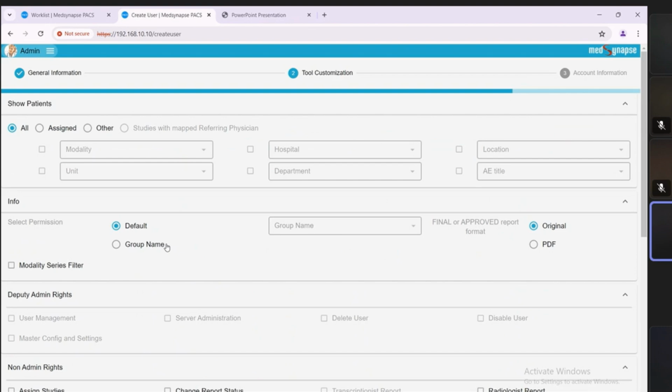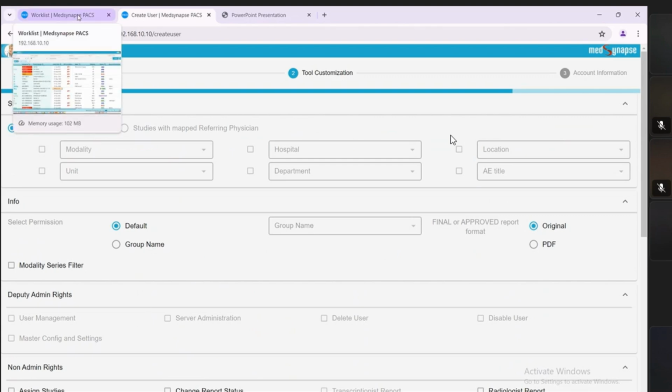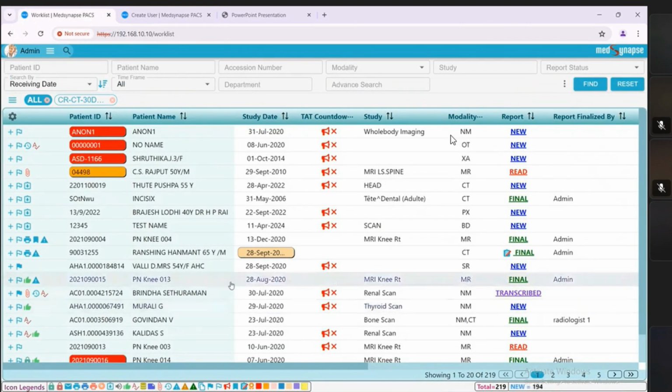But Mr. Sanjay, the radiologist workstation we were discussing has added features, right? Yes, it has additional features like printing, the reporting feature, and the report finalization feature. There are a few additional tools also. All those features are with the radiologist workstation. Okay, got it. And our zero footprint viewer is USFDA approved.